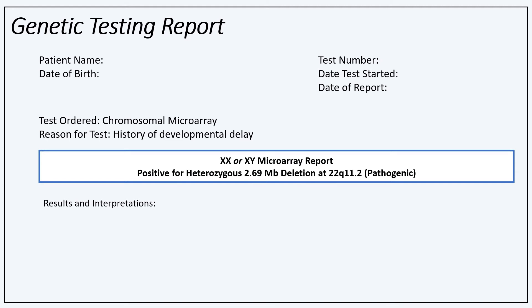On the screen is an example report we will walk through. This example report has a genetic change or copy number variant. First, we will briefly touch on what a microarray test can detect and what a copy number variant is before going over this example report.